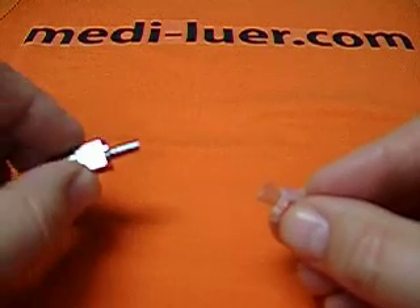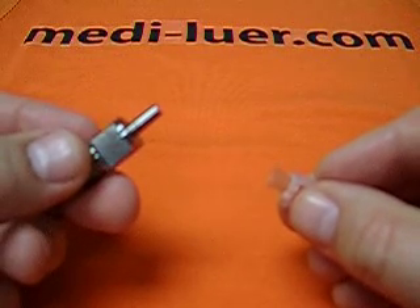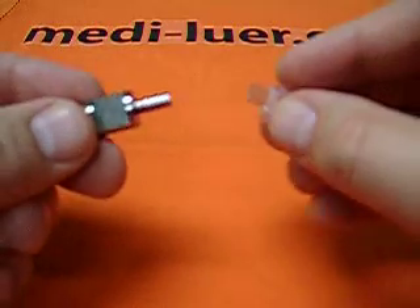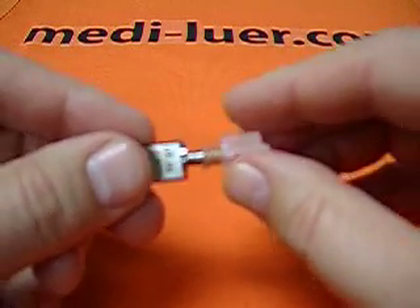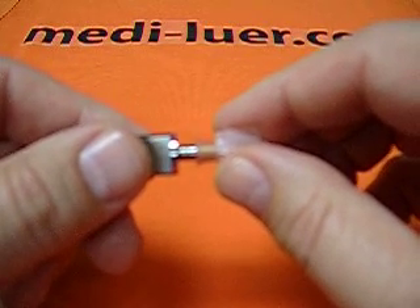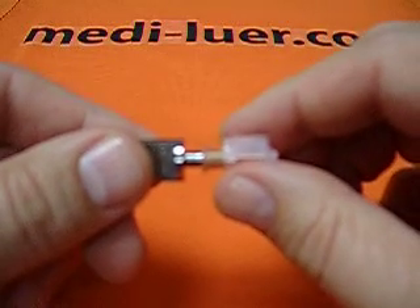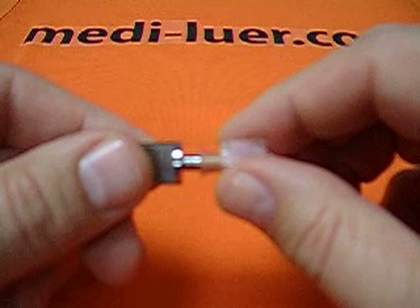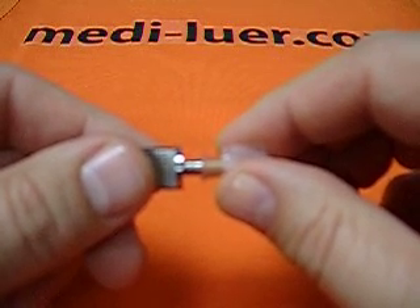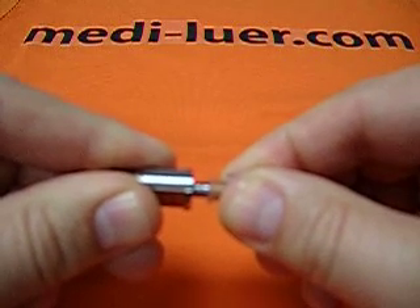When we're reading the standard and we're going to use a reference fitting, the standard puts some interesting requirements on us. It says that we have to assemble the fitting with not more than 27.5 newtons of force or pressure, while at the same time applying not more than 0.1 newton meter of torque, and we cannot rotate it more than 90 degrees.